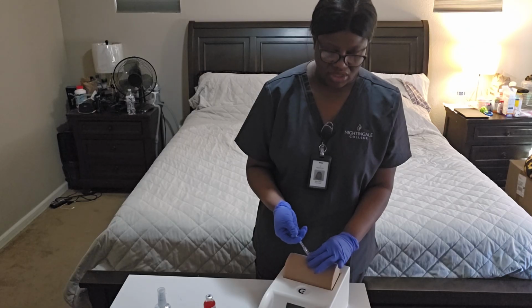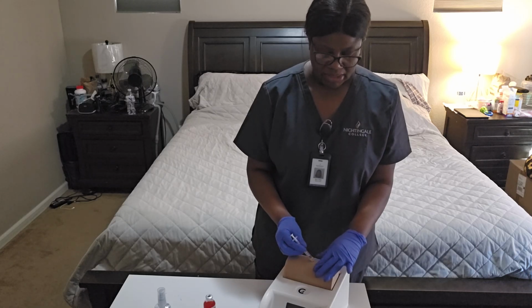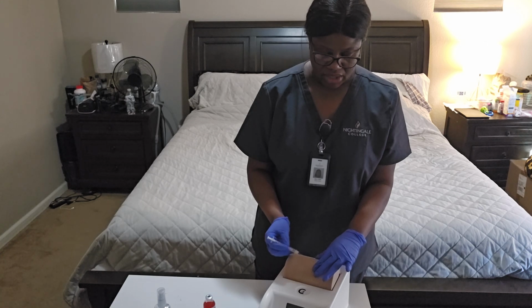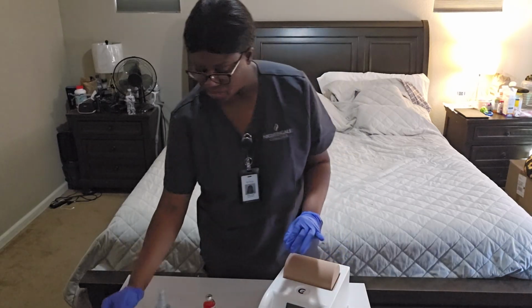Make sure everything goes in properly, slowly and properly. When I'm done, I'm going to take it out slowly. By the time, I'm going to see a wheal or a bleb, kind of like a mosquito bite. I'm going to dispose of this in the sharps container. I'm not going to recap.